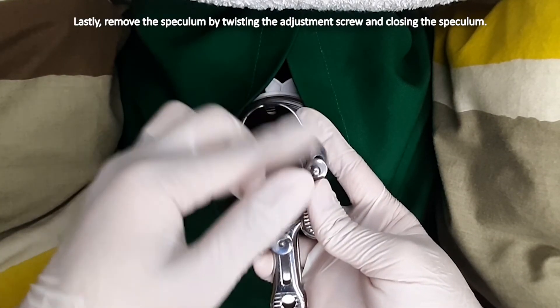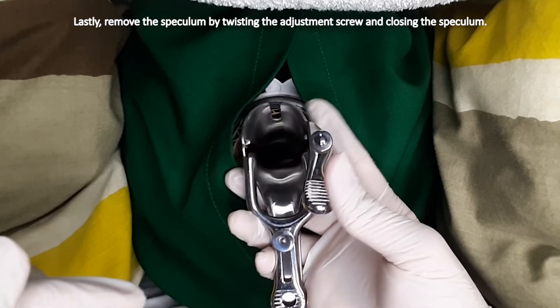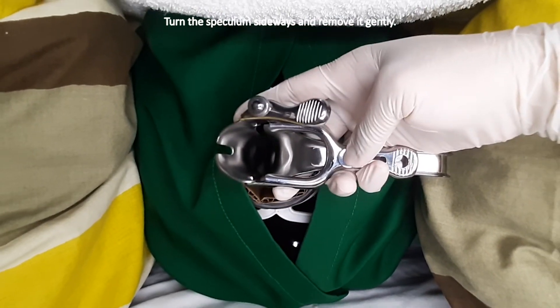Lastly, remove the speculum by twisting the adjustment screw and closing the speculum. Turn the speculum sideways and remove it gently.